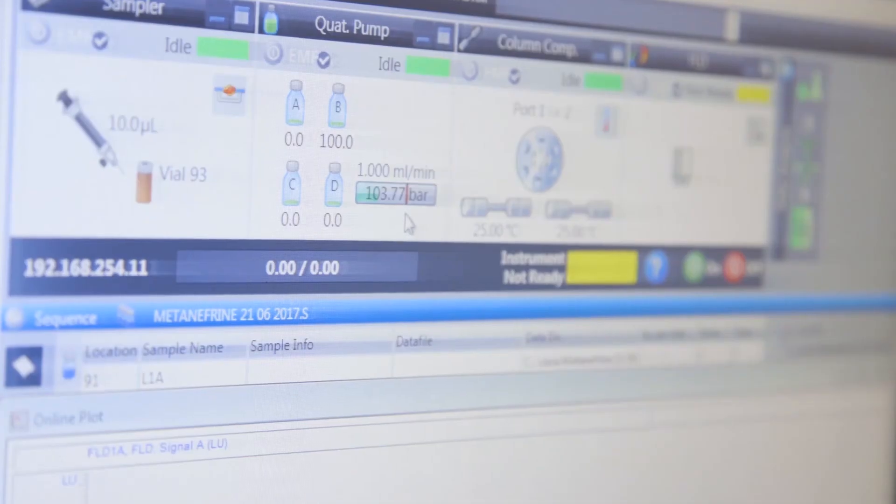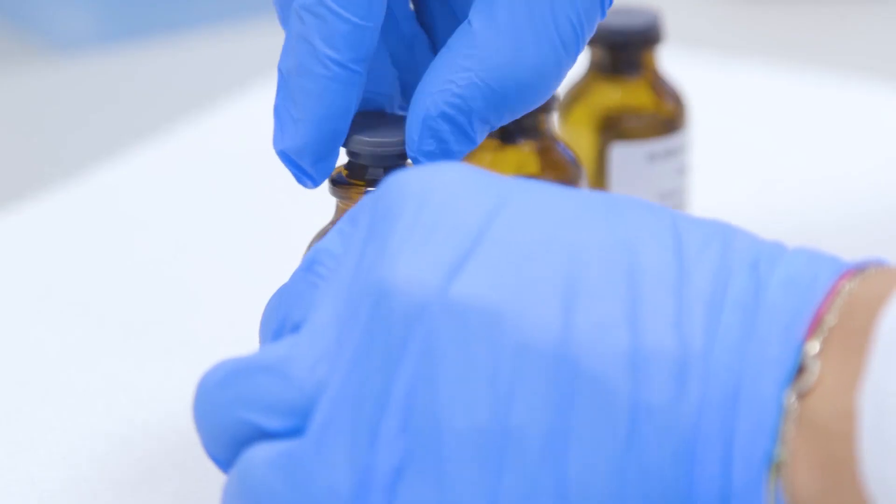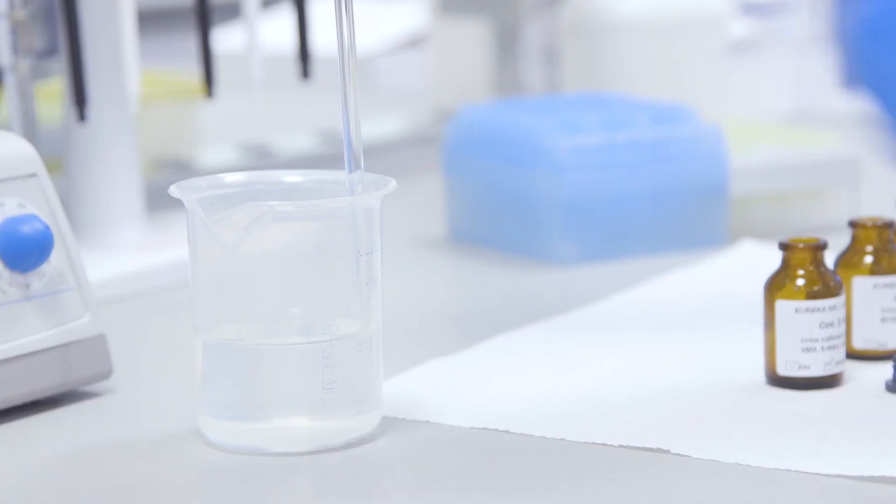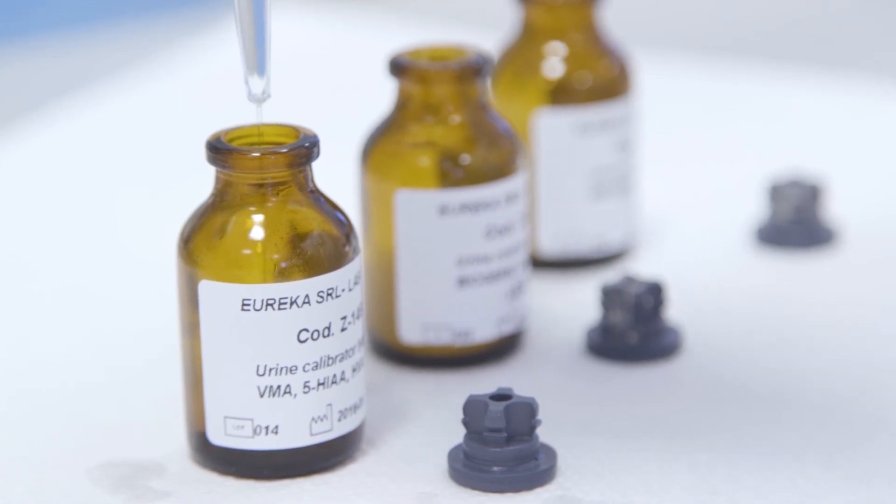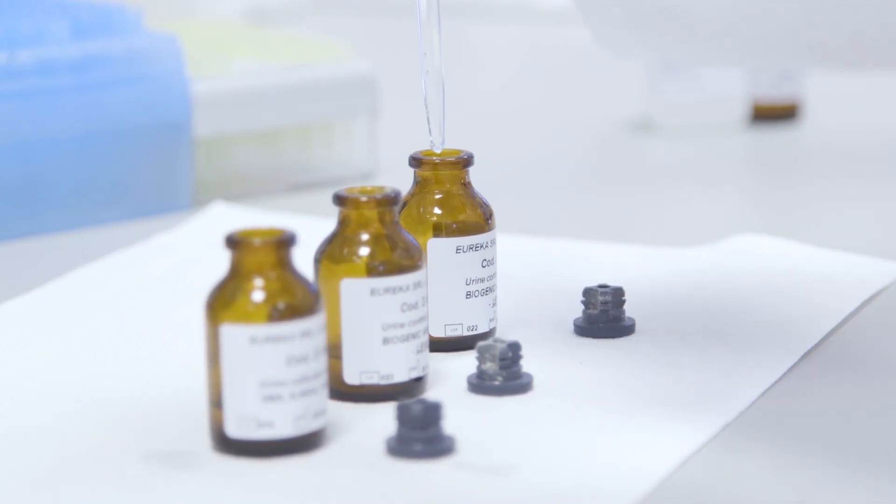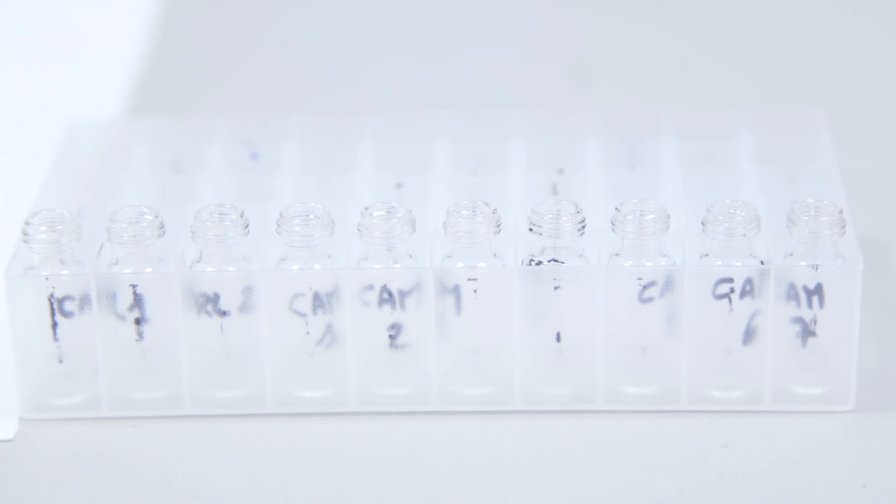Let's move to the workbench and rehydrate the calibrator and the lyophilic controls. Now we prepare a lot of glass goblet vials, as many as the samples to be analyzed, including the calibration standard and the lyophilic controls.